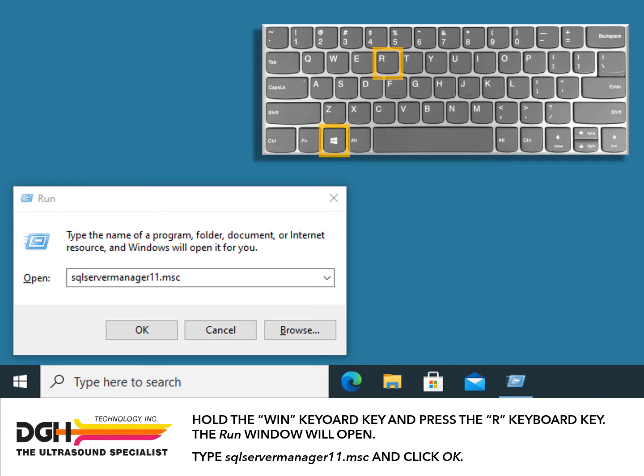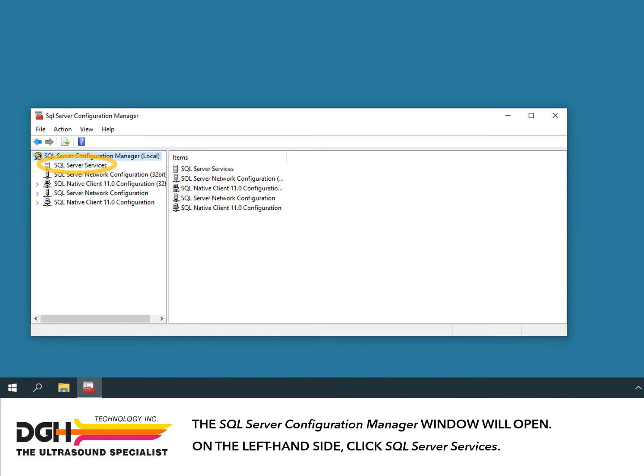Hold the Win keyboard key and press the R keyboard key. The Run window will open. Type SQL Server Manager 11.msc and click OK. The SQL Server Configuration Manager window will open.